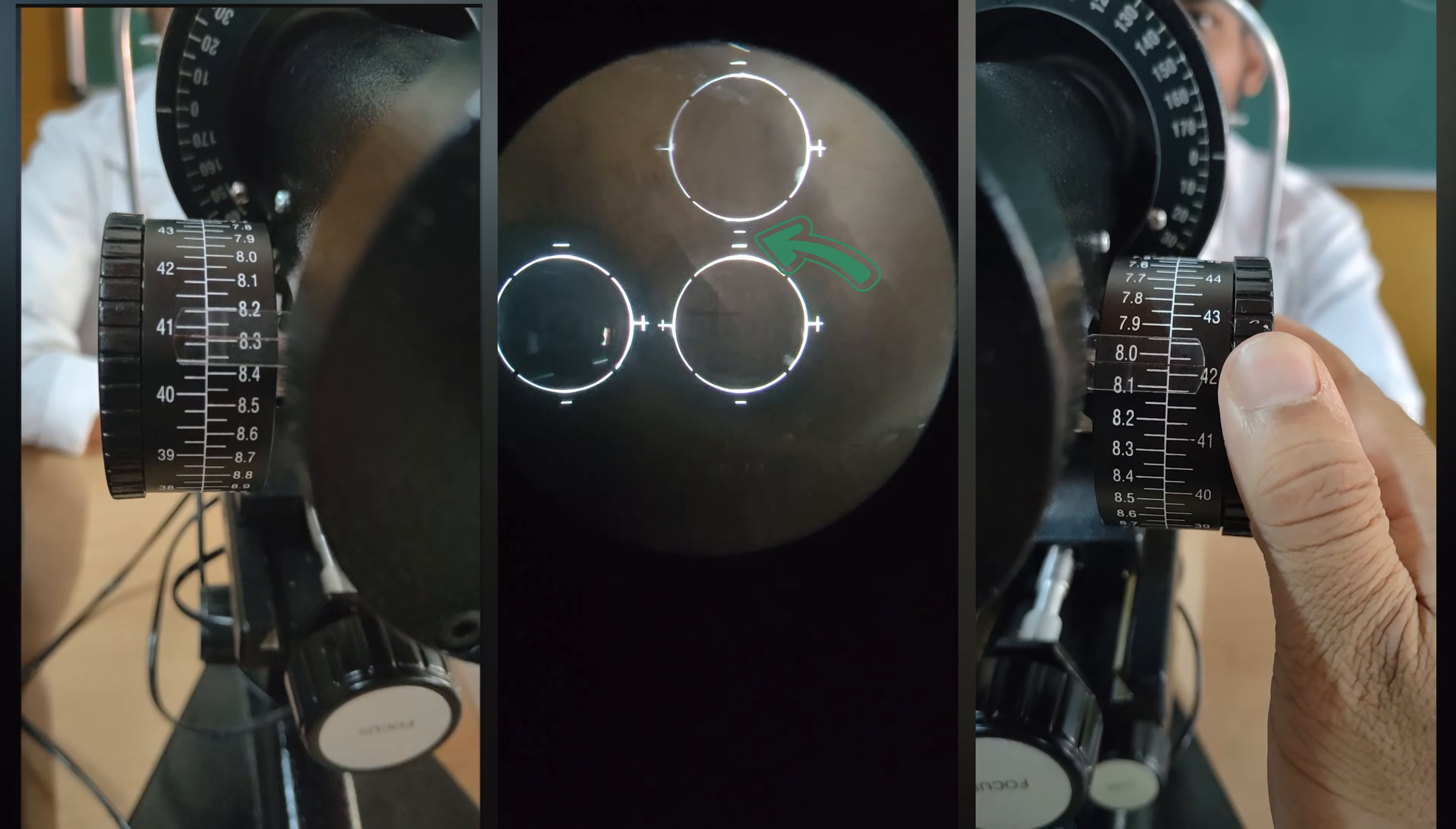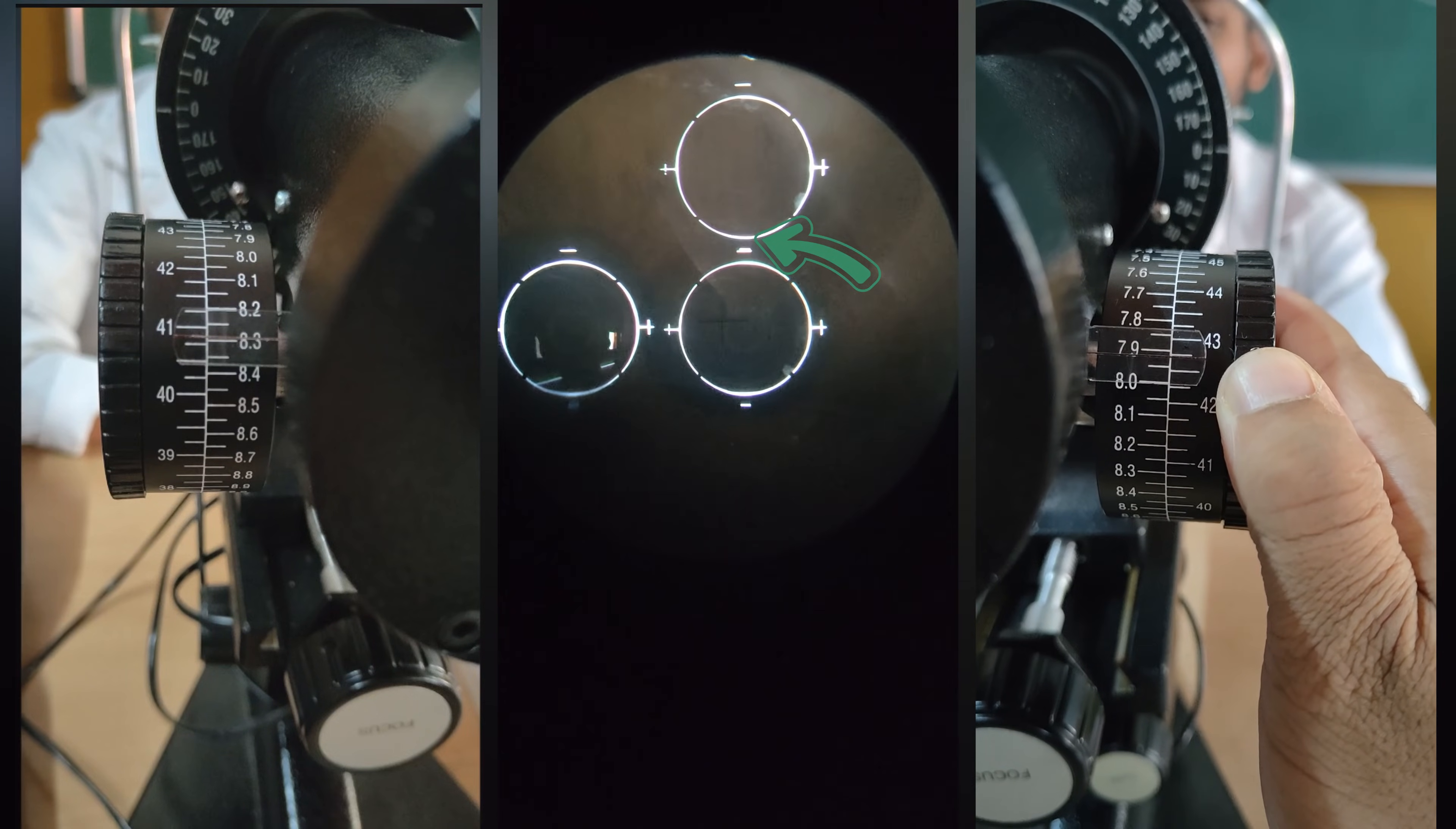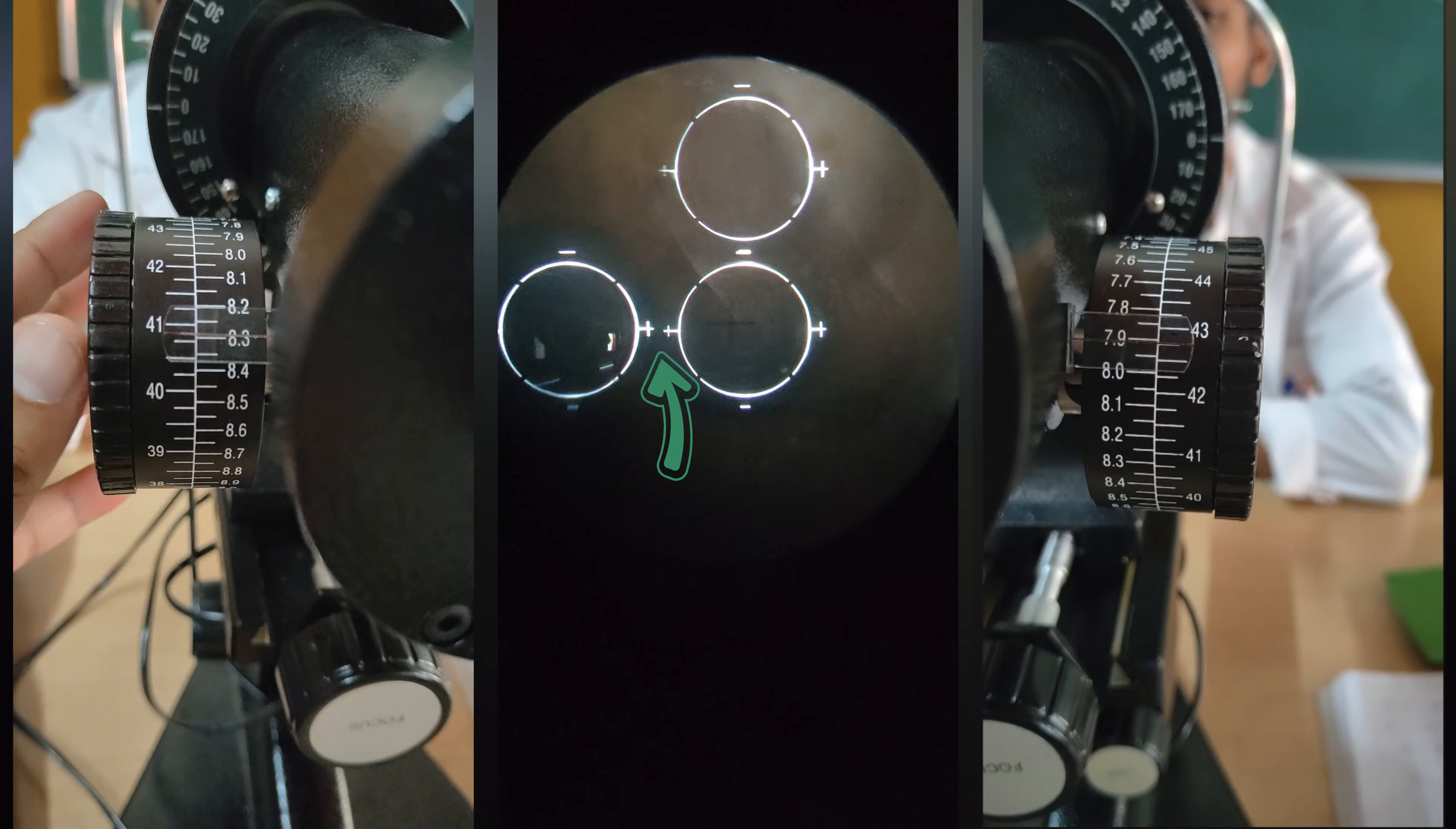Adjust the vertical wheel until minus signs are overlapping. Adjust the horizontal wheel until the plus signs are overlapping.